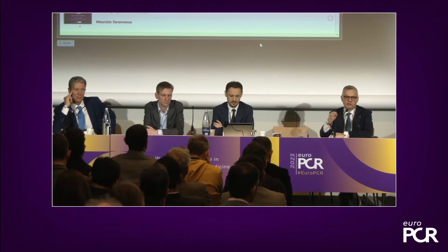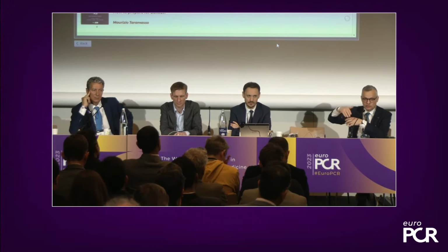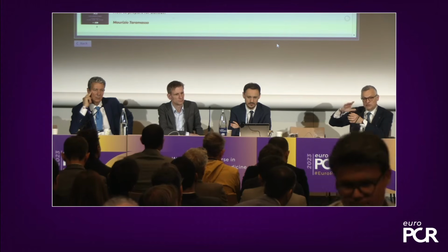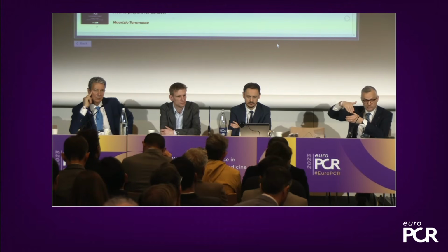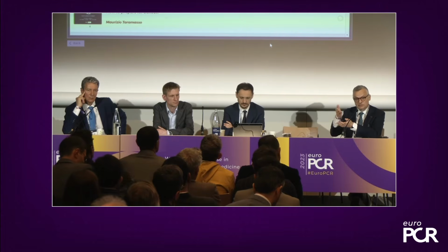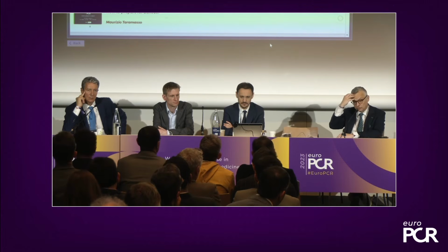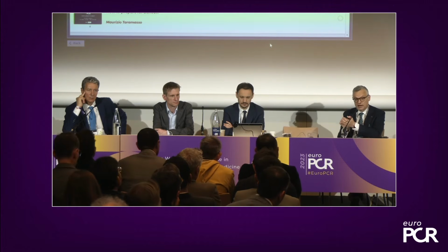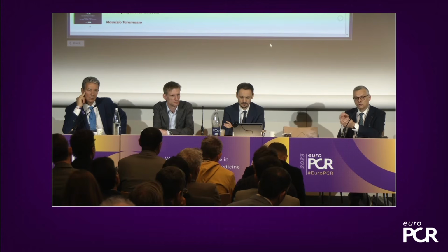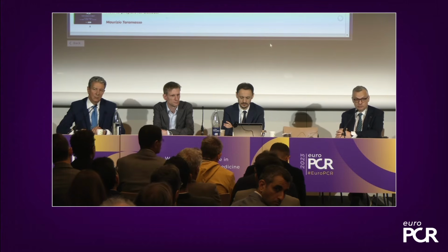Yes, in this case what you risk is that you get into the area of the femoral artery that dives into the iliac fossa, and therefore first of all you will not have any more the chance to deliver at 45 degrees, because you have an angle that you cannot win even with your positions, and you may get the suture inside of the vessel. So again, in my opinion, you really need to figure out in your mind where exactly is the depth at which you get the entrance of the artery, and don't go more than 2-3 millimeters beyond that level, otherwise you may get into trouble.